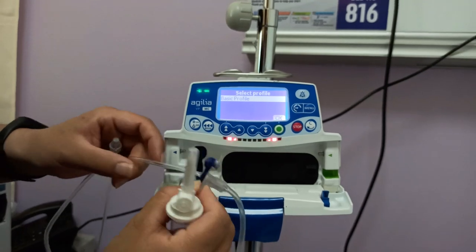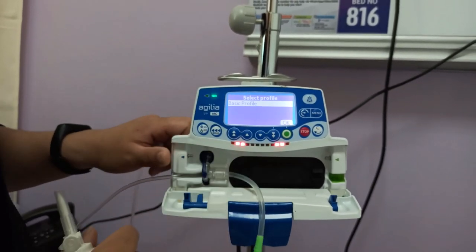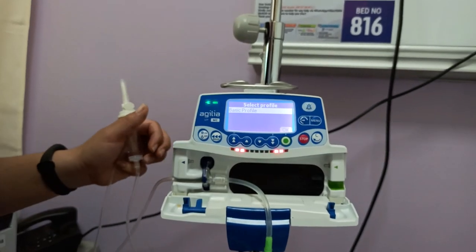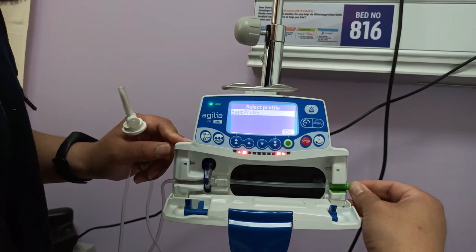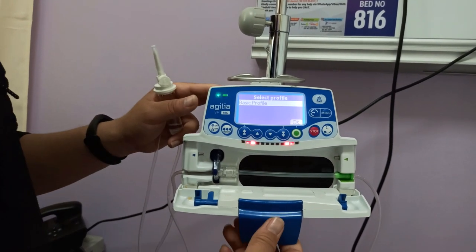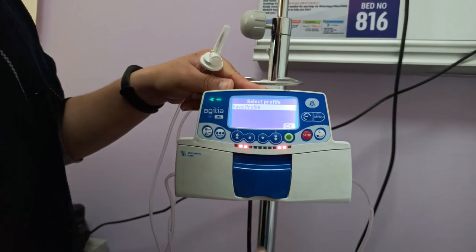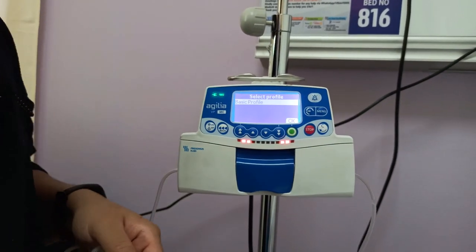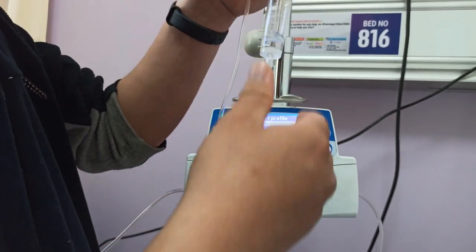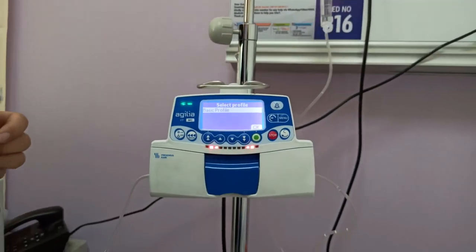The blue part is color-coded to match the blue notch and the green part matches the green side. Place the blue part into the blue notch so the IV line sits correctly. Then pull the green part slightly and place it in position. Close the door. There is only one profile — the basic profile — so no changes are needed. Insert the fluid to be delivered to the patient; for demonstration purposes we are using normal saline, fixing it into the infusion set.